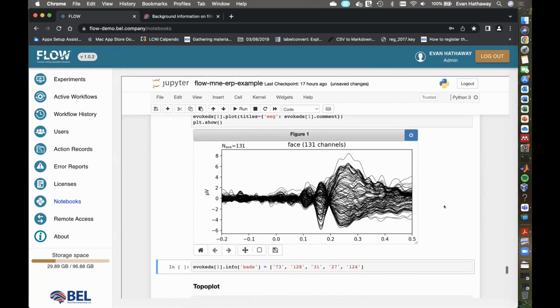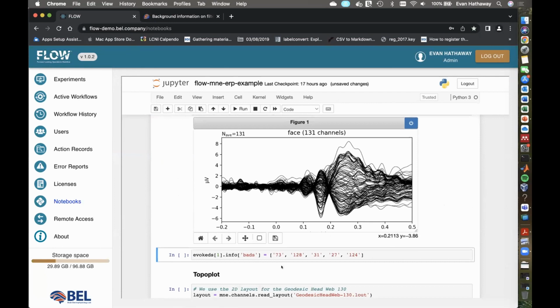Here's the other average. So same thing here. We've set a list of the bad channels for this one.